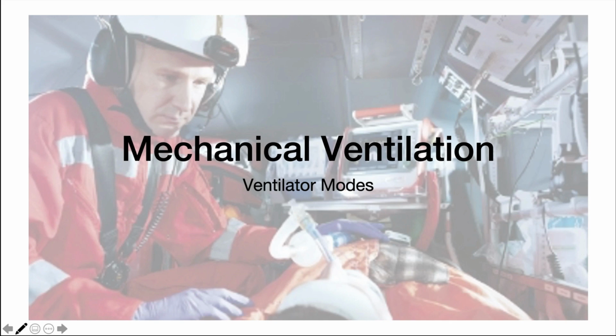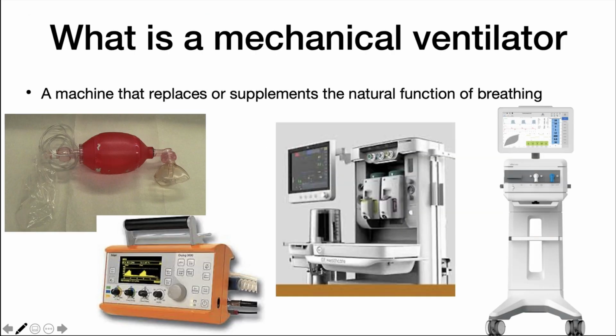So welcome along to this presentation where we'll be discovering some of the ventilation modes, giving an overview of the indications for ventilation and a brief talk on how mechanical ventilators actually work. So what is a mechanical ventilator?